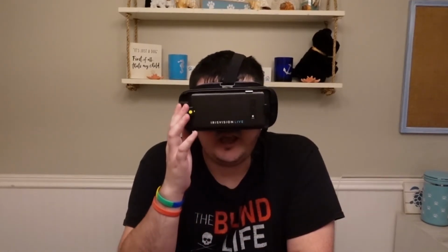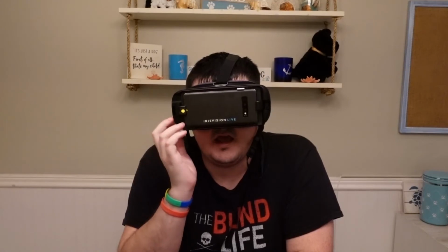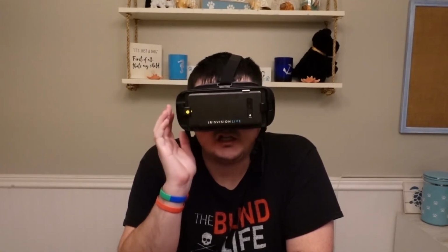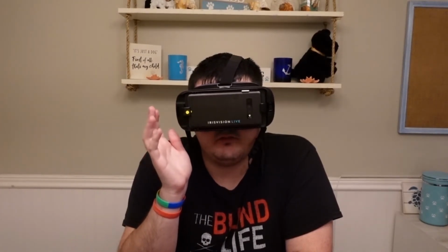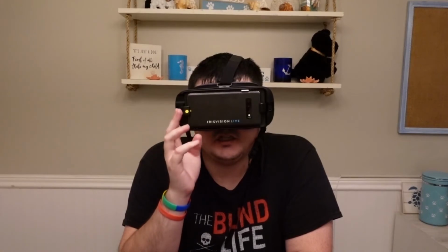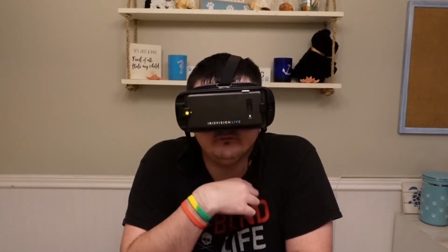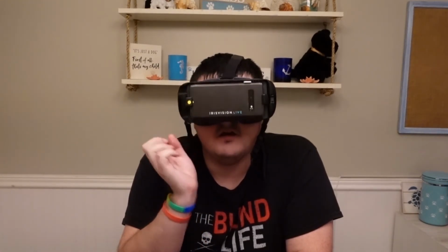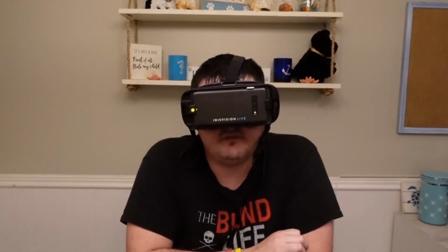Also, this does have a tendency to overheat if you use it too much, and if you overheat it and then put it straight on the charger, you actually can run the risk of damaging the device. So you've got to be pretty careful managing how much you use the device and that you're not overheating it. And again, it also doesn't have the longest battery.